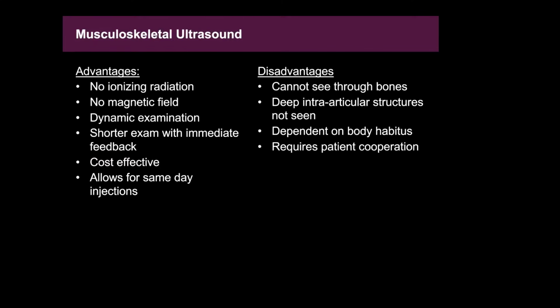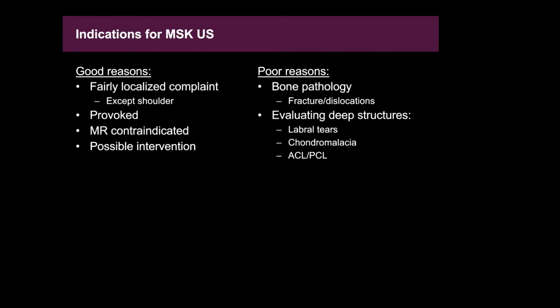So these are the summary slides of some of the advantages and disadvantages of MSK ultrasound. I won't repeat myself, but it basically just summarizes everything that we just talked about. And these are some of the good indications for MSK ultrasound, again just summarizing everything that we've discussed up to this point. If you want to go back and rewatch this lecture, you can just screenshot this slide if you want to have a good reference sometime in the future.